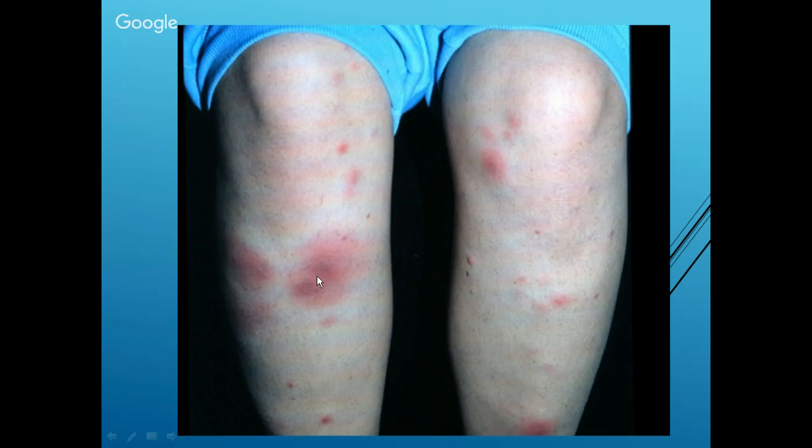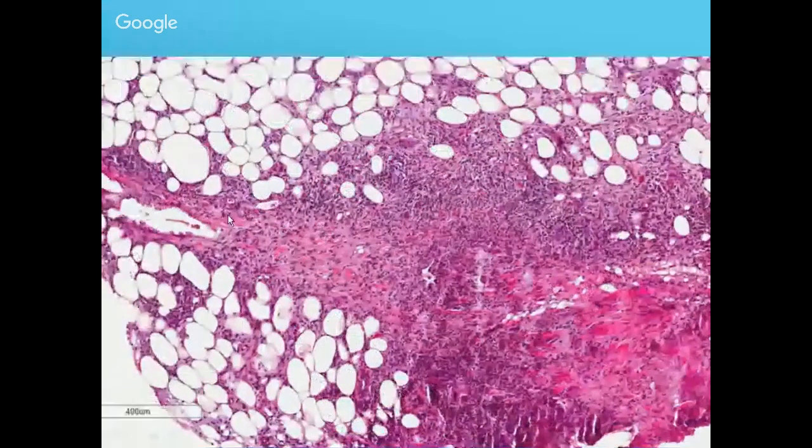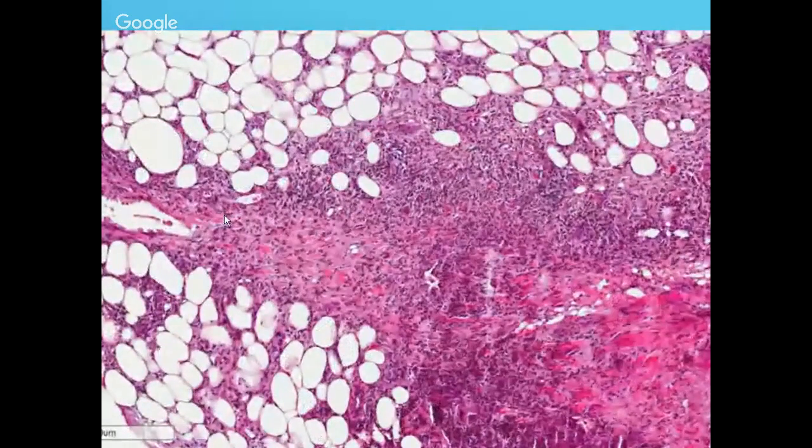actually. And the last reaction pattern, very classic. So where is the action here? So the epidermis looks normal. In the dermis there is some mild inflammation, but the main action is happening in the subcutis actually. And so this is panniculitis actually. So in the panniculitis, what are the two things that you want to look for? Is the inflammation limited to the septa, or is the inflammation going into the lobule?